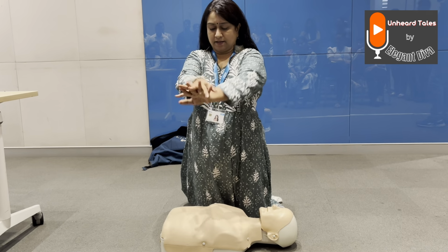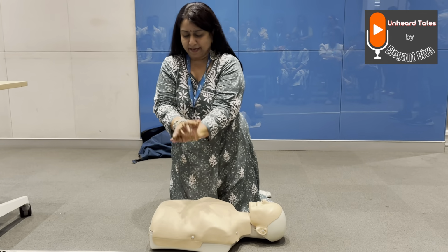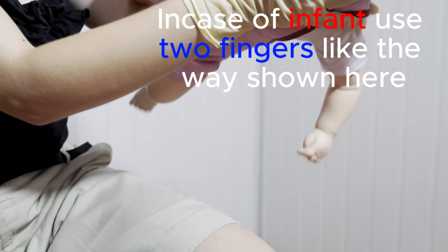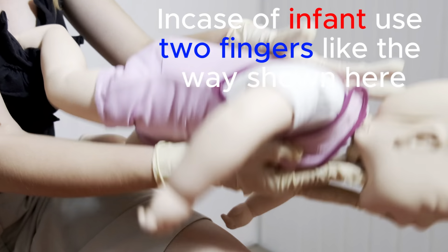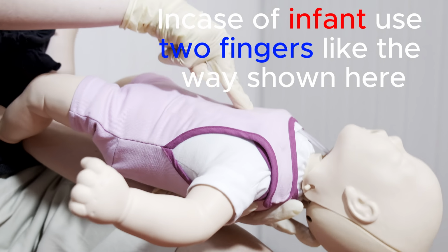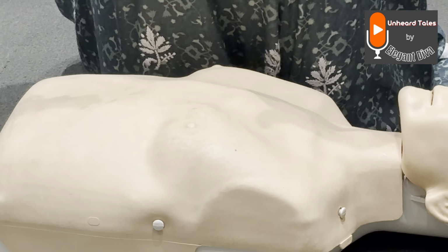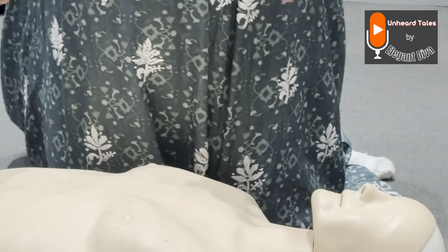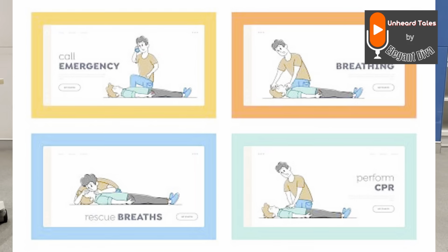Place your arms. The arms have to be straight and perpendicular. Place the heel of your hand in the center here, and you have to compress: 1, 2, 3, 4. While compressing, it's important that you don't move like this. The more you move your body, the less force will be transmitted. Now this is a mannequin. It's very easy to do this. Imagine a real body. It's very difficult because it's hard.